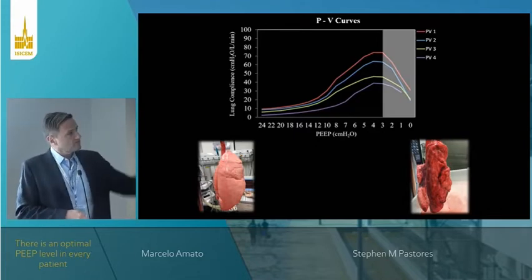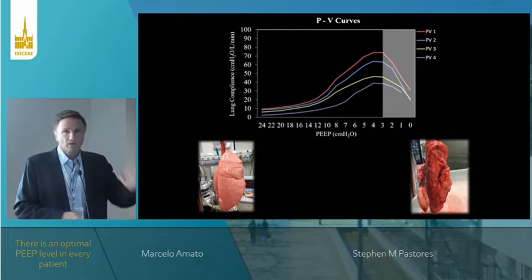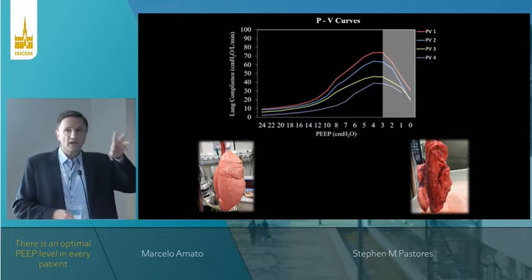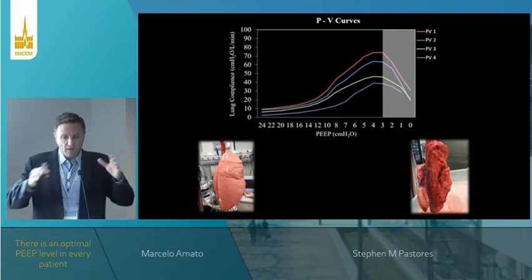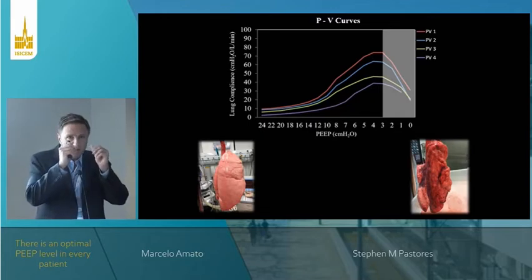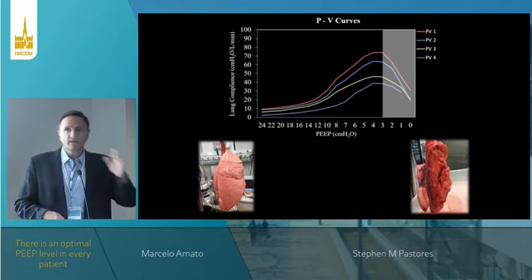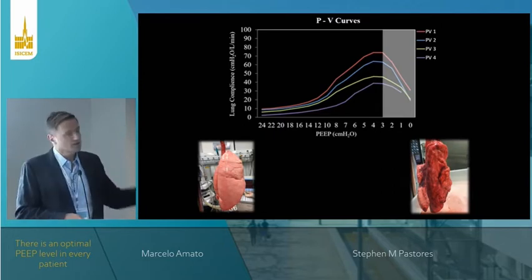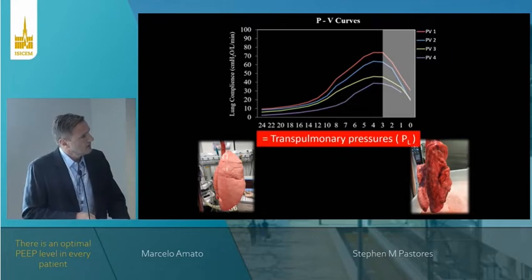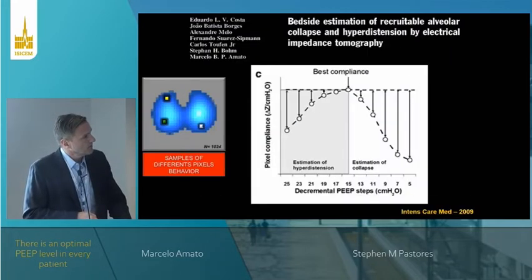Series of lungs, same results, always between +2 or +3. All the lungs were getting some collapse, especially airway closure collapse. So if you look outside, it's not much changing in terms of the color of the lung, but functionally, the lung is not working any longer. So it's truly airway collapse. So again, transpulmonary pressures of +2 and +3.